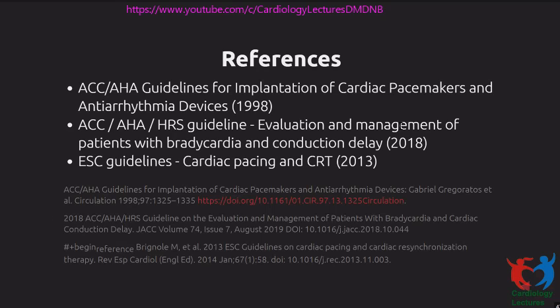So here, usually you can take a decision in discussion with the anesthetist. Most of the time what happens is they prefer to have some pacing support during surgery, so we put in a temporary pacemaker on the day of surgery, and you can remove it the same day after surgery. And so your decision to permanent pace them need not be decided by the need to undergo surgery. So they undergo surgery with the temporary pacing, and your decision regarding PPM is done as usual based on guidelines and discussion with the patient.